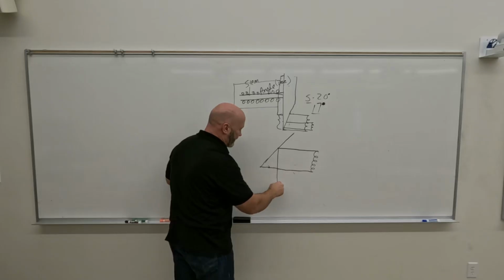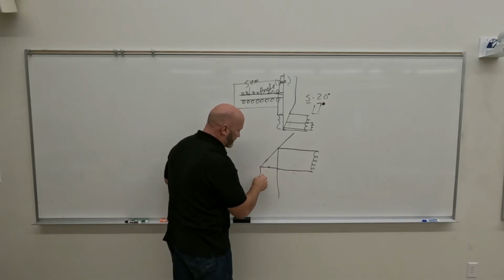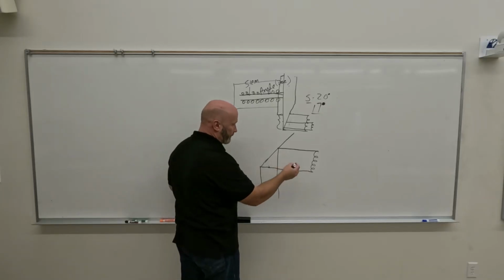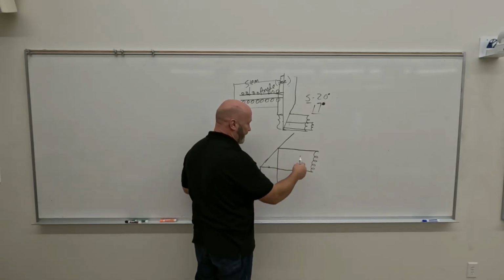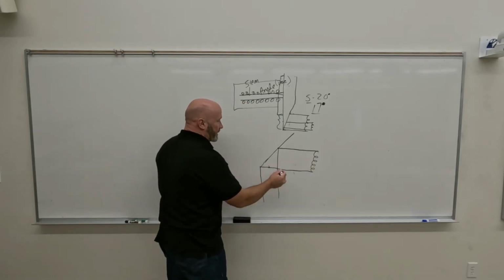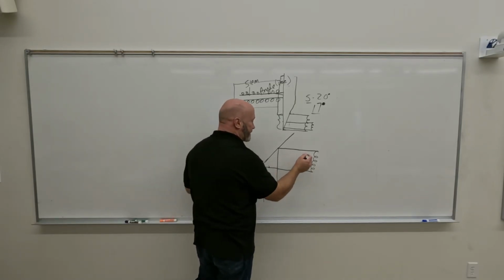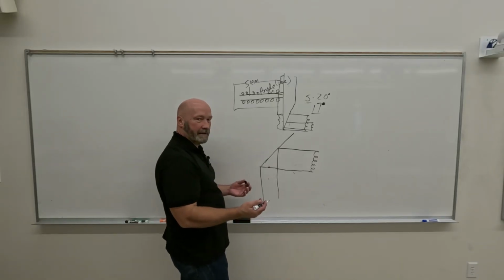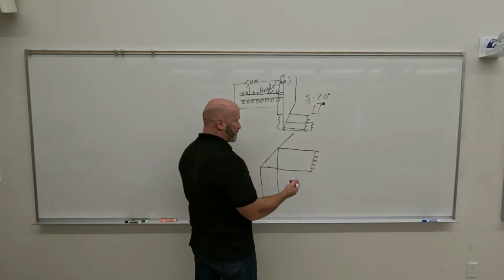Then the stream of electrons would be exactly the same size. It's not in this case because I'm not at a perfect 45-degree angle. I can't draw a straight line to save my life. But our stream of photons will be the same size as our stream of electrons. Can you kind of see how that is? At 45-degree angles, that's what we get.